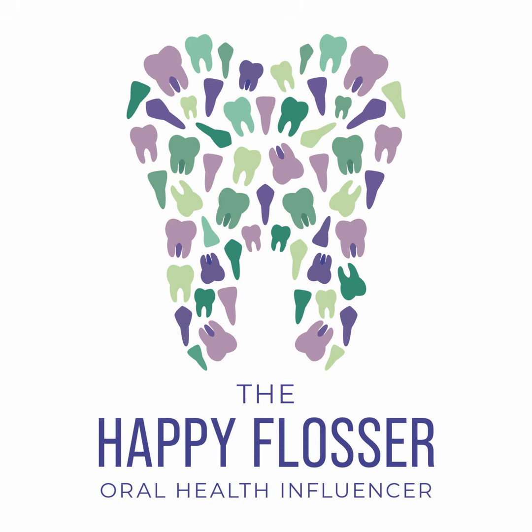So I would say, just like when you have a patient in the chair and you're trying to take the impression, when you're in the dental materials lab and you're trying to pour up the impression, the same details go into it. You need to be slow and steady, also keeping in mind that your working time with the stone is also a factor, and the temperature of the water also matters when you're using the stone. These are all factors that impact your working time and your results or your outcome.